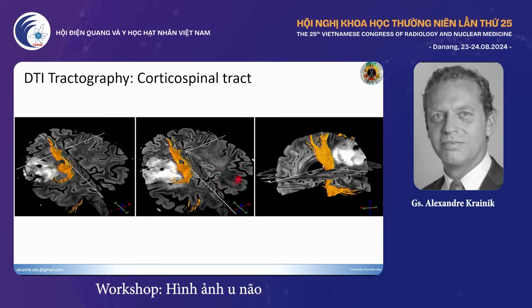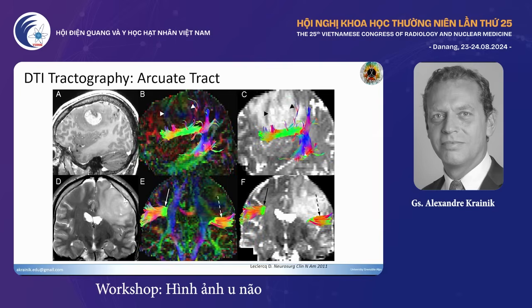Here, obviously, it means that you can't say there's no neuronal fiber. You can only say that you don't see them.